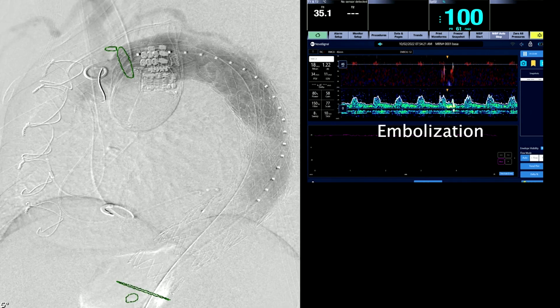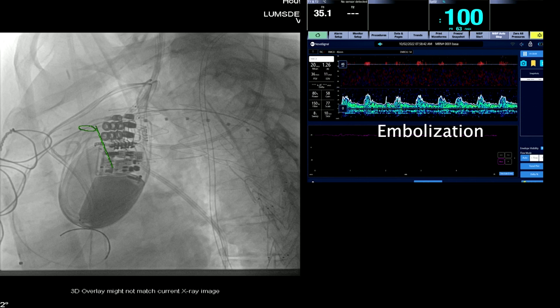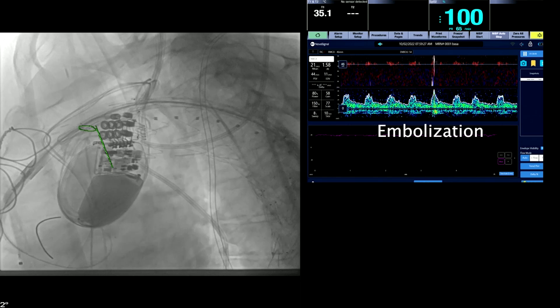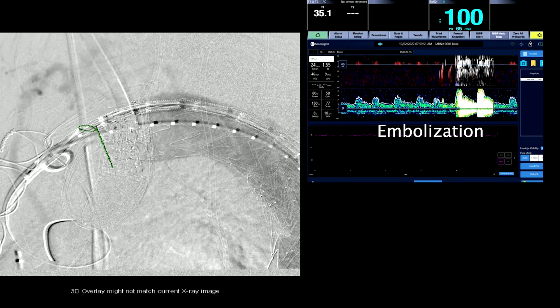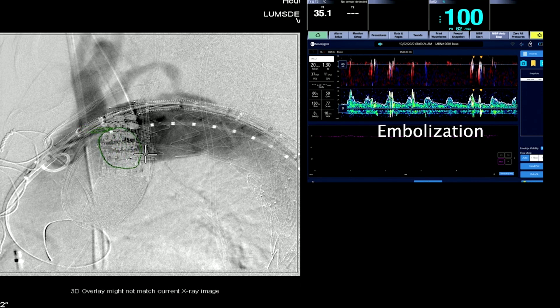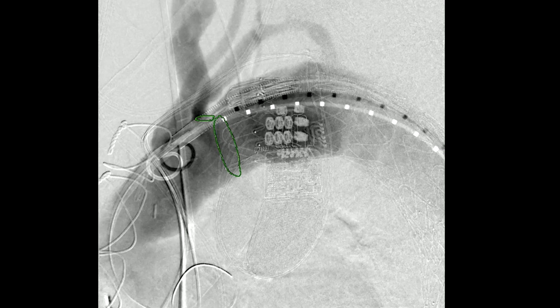You're always watching that wire because it tends to come back. When you inject dye you can actually see evidence of embolization — that's why it's so important to know what's going on inside the chest versus inside the head. So we're repositioning the Lunderquist wire and optimizing the proximal landing zone, opting to extend a little bit further. Here we're being pretty aggressive on the subclavian artery. We really need to know what the subclavian origin is and that the fusion marks are correct. Any embolization at this point is probably gaseous rather than particulate.